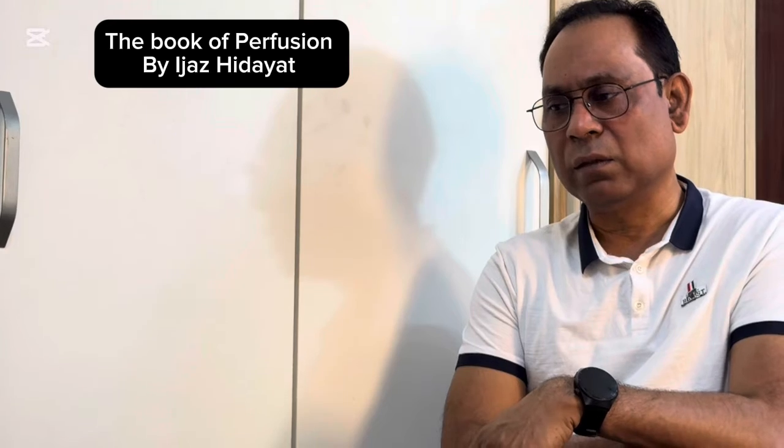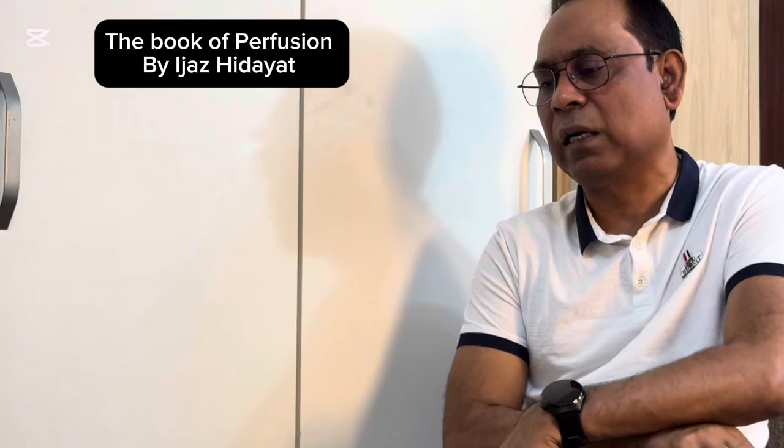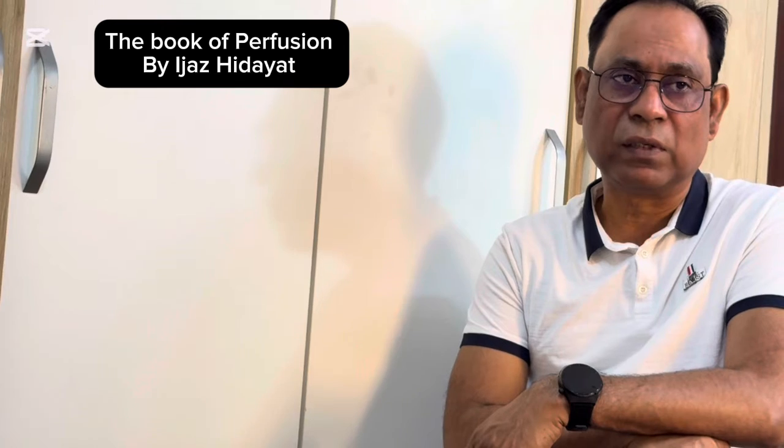In my last talk I gave a presentation regarding goal directed perfusion. So your target of perfusion during cardiopulmonary bypass, especially in Marfan syndrome patients, is goal directed perfusion. The DO2 index should be around 280 mL per minute per meter squared, and manage your blood gases. This is from my side on how to manage Marfan syndrome patients who are going on cardiopulmonary bypass, on the heart-lung machine.